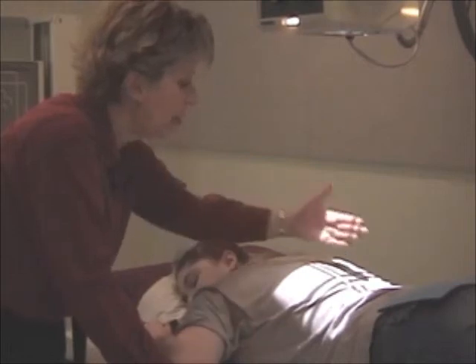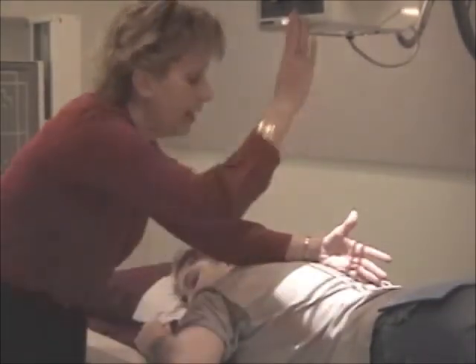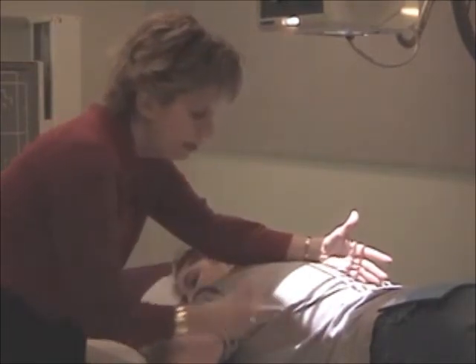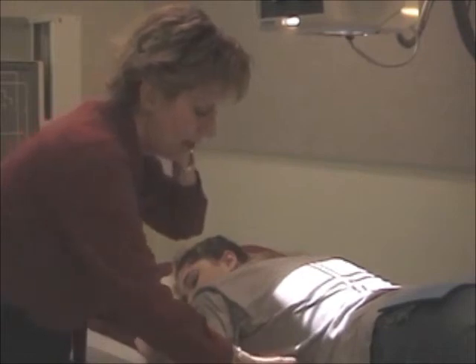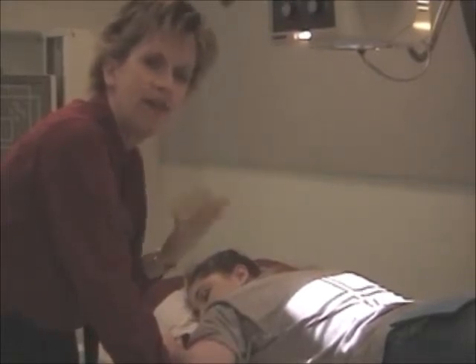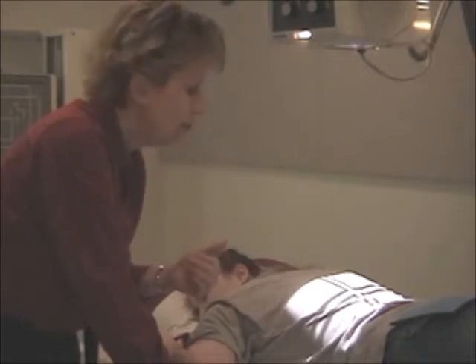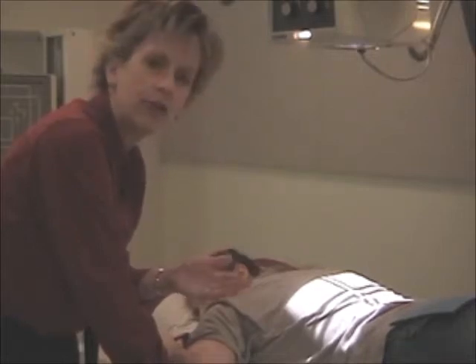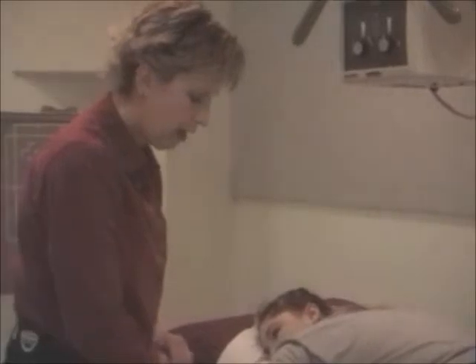Now Ballinger's actually recommends that you take the spine and the lateral aspect and center over the left side, but you can tell if I scooted the patient any further that way, I'd be x-raying tabletop. So I'm going back to that rule of thumb. X-ray tabletop gives the doctors no valuable information at all. Do not x-ray tabletop. So our centering is a little bit different than Ballinger's, and we've just given you rationale behind that. And I've demonstrated a couple stomach positions for you.